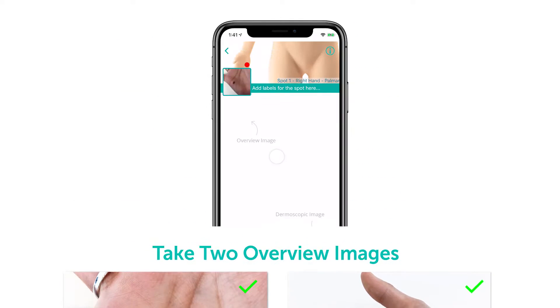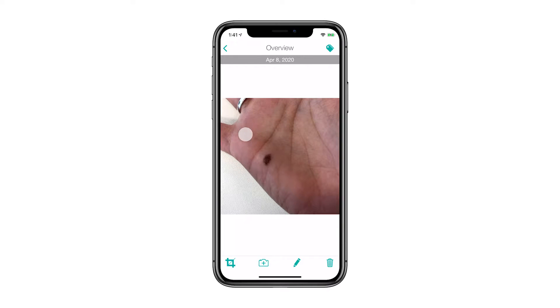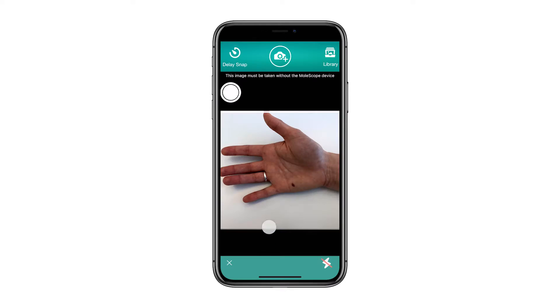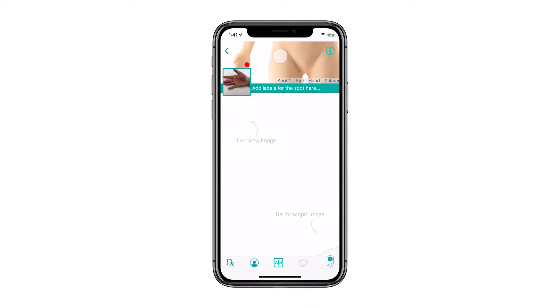To add additional overviews, tap overview again and then press on the add photo button. Continue imaging by repeating the same process. To view these images, simply press on the overview image.